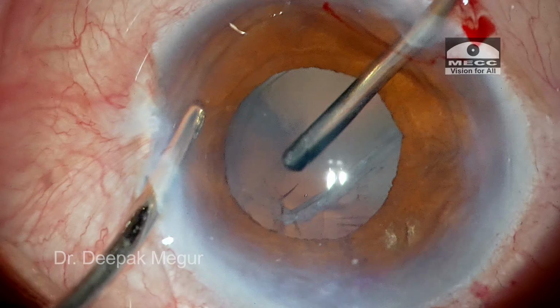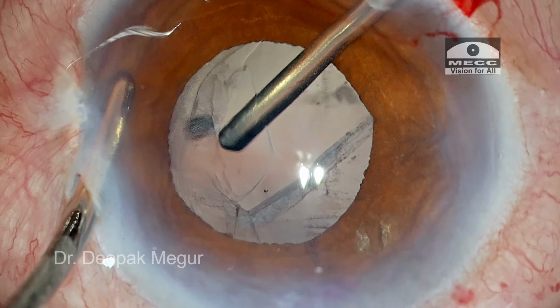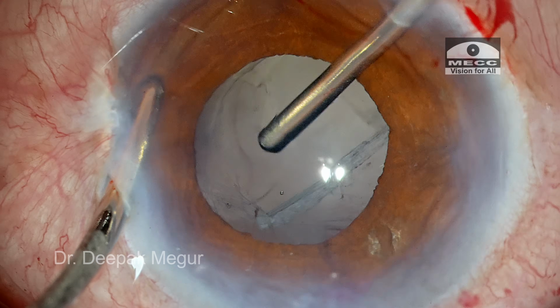I begin by keeping the bottle height a little bit low. The cutter is introduced into the eye with its bevel facing down, and I begin the anterior vitrectomy.